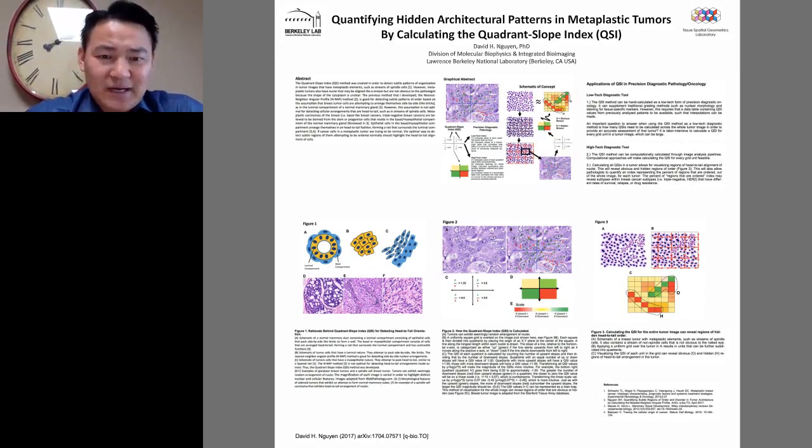Okay, and so there is existing evidence, if you look at Figure 1, that tumors do have an inherent order to them that we have been aware of for a long time. This is why tumors can be graded by a pathologist as grade 1, grade 2, or grade 3, being the most aggressive. And the grading system of tumors is based upon features such as nuclear morphology, the pink or purpleness of the hematoxylin eosin stain in the tissue, and other factors.